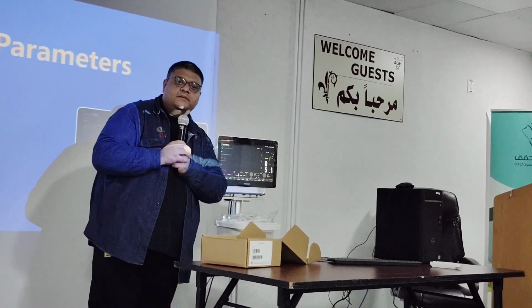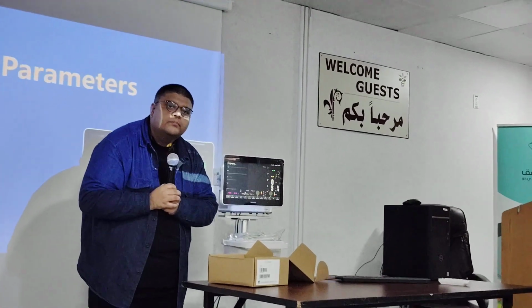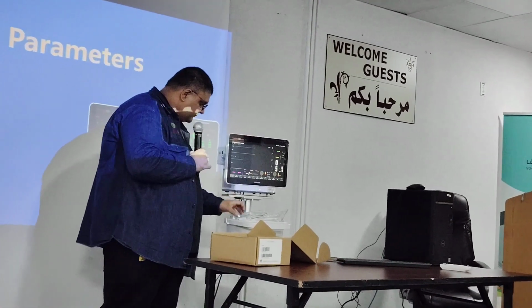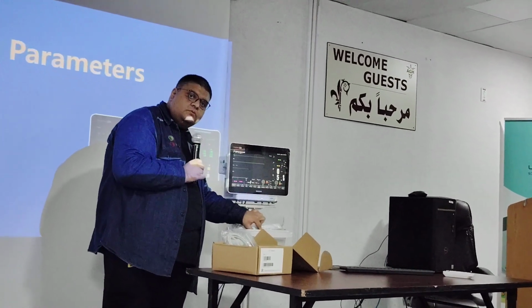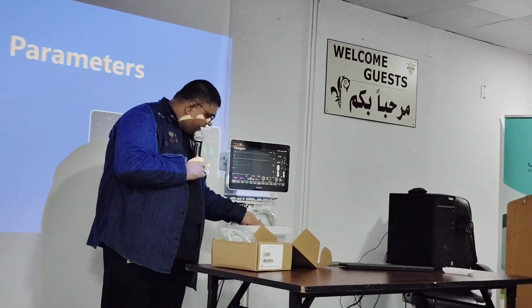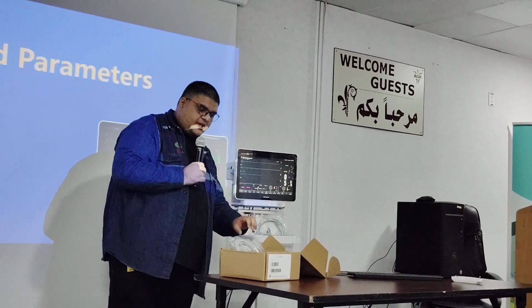Sir, how about this pediatric probe? Sorry? Because we have a pediatric probe. Pediatric probe, yes, because we only have adult. And it will not be detached. SpO2? Yes, yes. We have a pediatric probe. Here, this one is an adult one. We have pediatric probes.